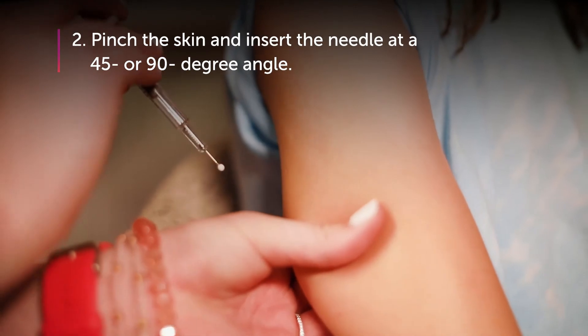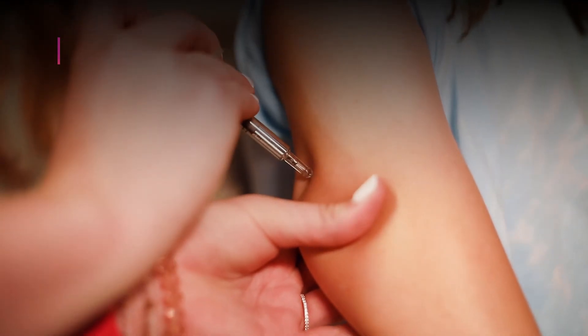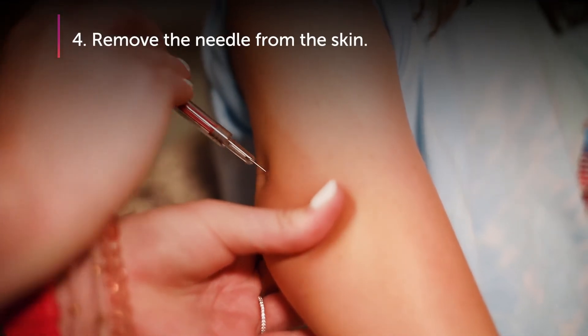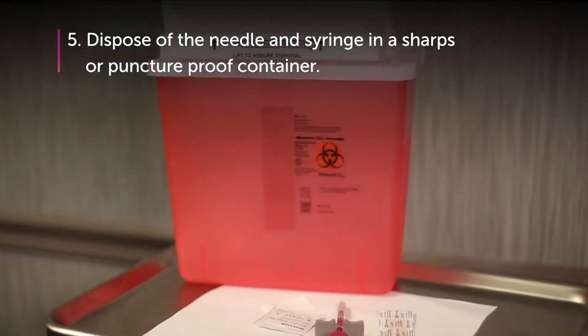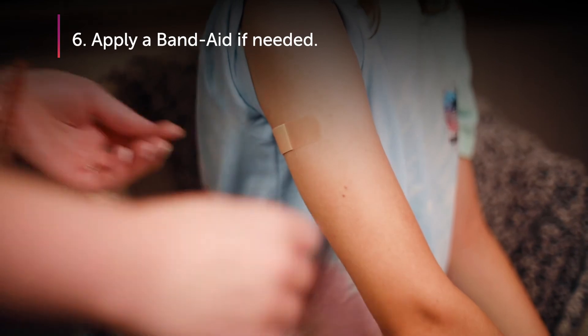Step 2: Pinch the skin and insert the needle at a 45 or 90 degree angle. Step 3: Push the medication in at a moderate pace. Step 4: Remove the needle from the skin. Step 5: Dispose of the needle and syringe in a sharps or puncture-proof container. Step 6: Apply a band-aid if needed.